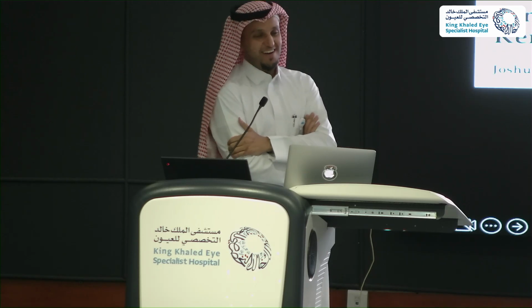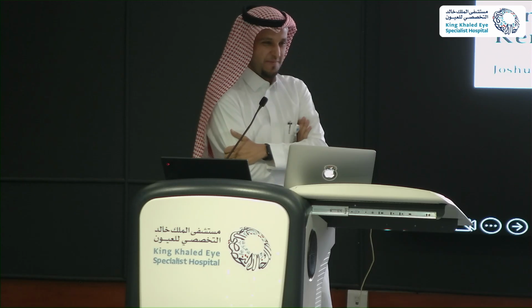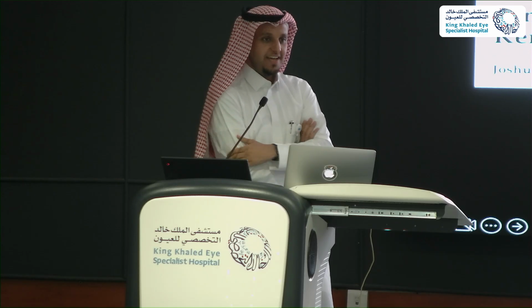Anesthesia, of course. So to solely depend on Femto, I strongly discourage this. You can use it in some difficult cases, exceptional cases, that is to be done every now and then. But to solely depend on your Femto, I strongly discourage this, even in cataract surgery.